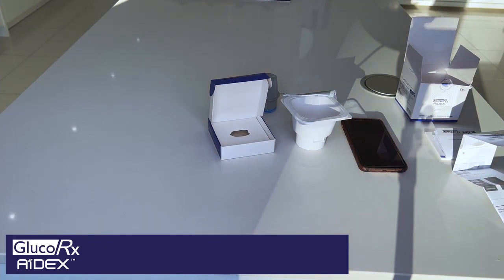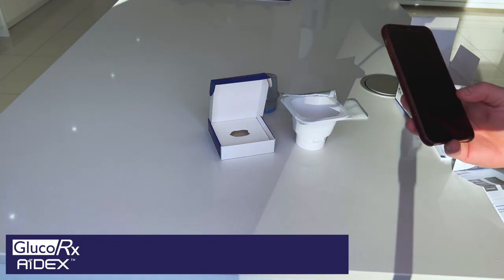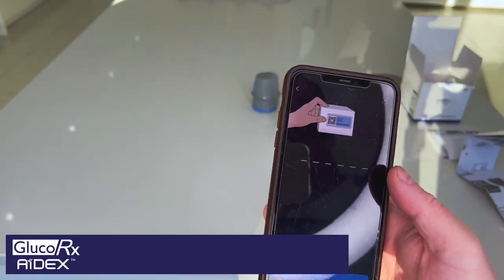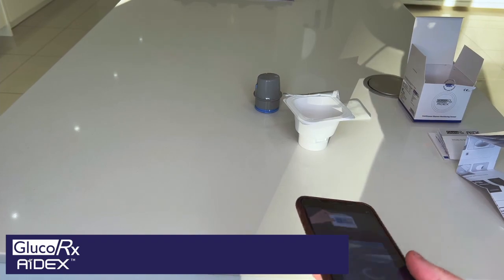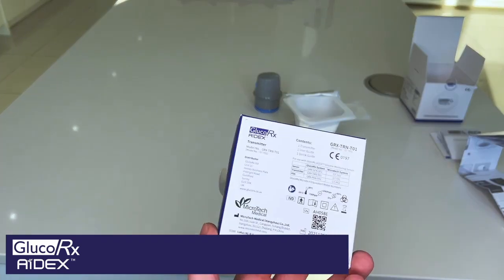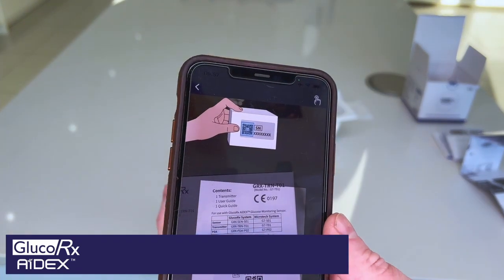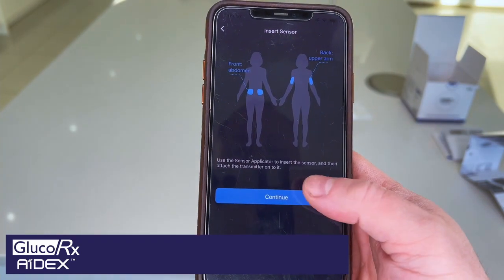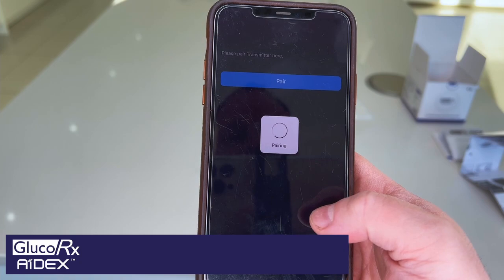So all you need to do now is with your smartphone — you need to scan the back of the transmitter QR code. That's then taken the code. I've then placed it on the back of my upper arm, so I'm going to continue.